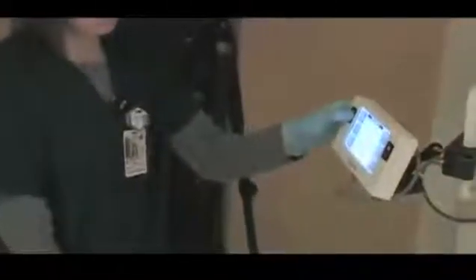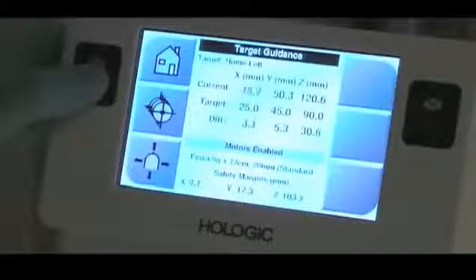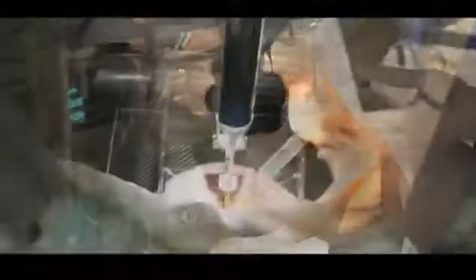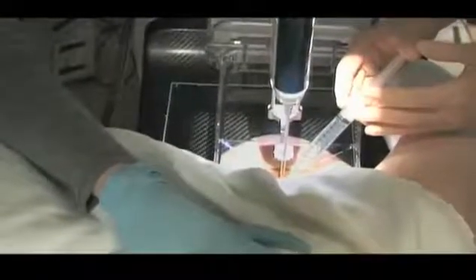Check the security by gently pulling back on the device. Activate the automatic targeting system by pushing the motor enable buttons to move the device to the identified X and Y coordinates. Using the manual Z-dial, move the Aviva needle tip to the skin surface to ensure accurate anesthetic placement. Inject anesthetic to numb the skin surface at the area of interest. The tip of the biopsy needle will extend beyond the target site, so it is essential to administer anesthetic to all affected tissue by injecting deep to the target site.